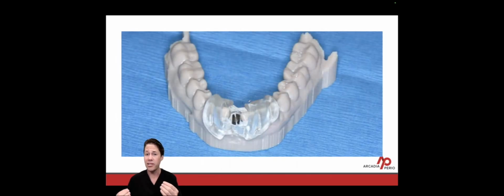What I still like to do to this day is I will print a model and then I will try in the guide to make sure it fits passively so that I don't have to be adjusting this chairside at the time of surgery.